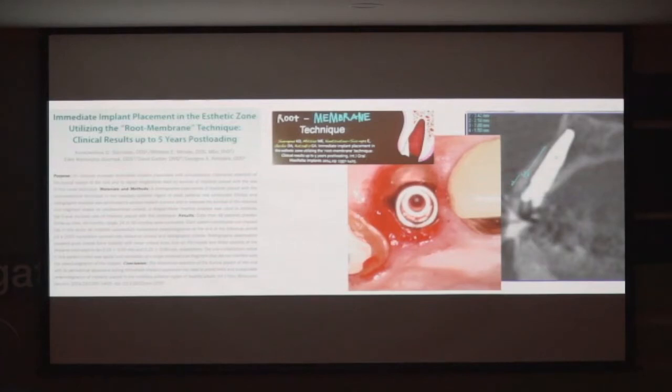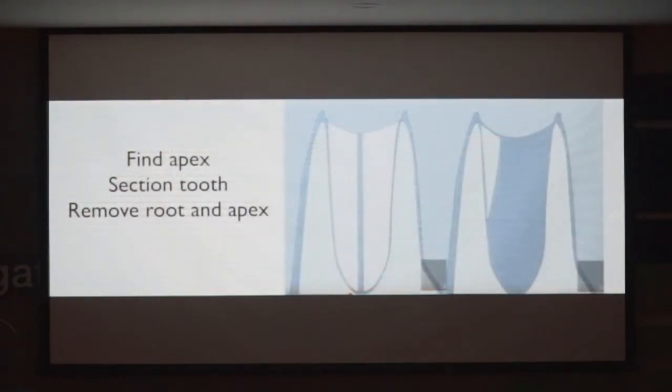What I would do is, I had a patient who I was going to extract a tooth on, but before I'd extract it, I'd try to do the socket shield. I knew I was going to take it out, and I couldn't do it. I wasn't good enough to do it. And then along comes dynamic navigation. So what are we going to do here?